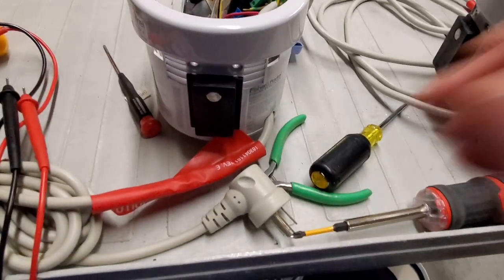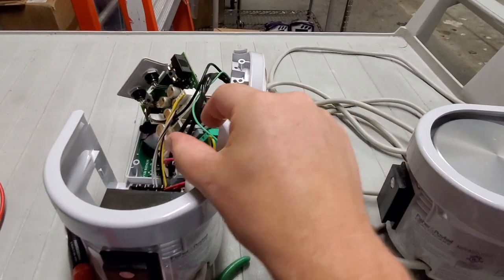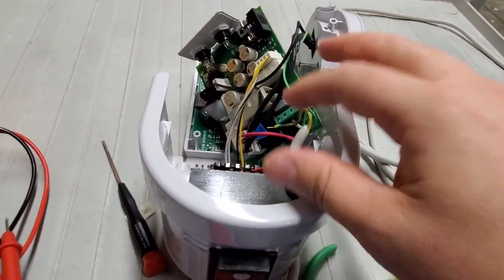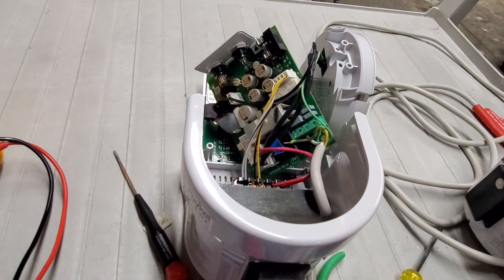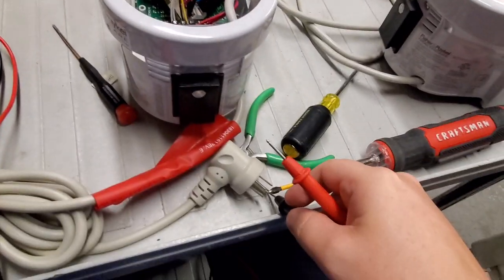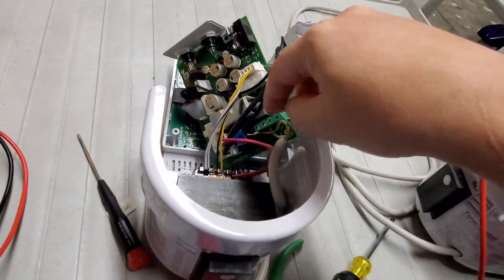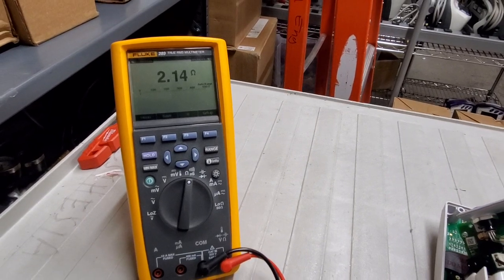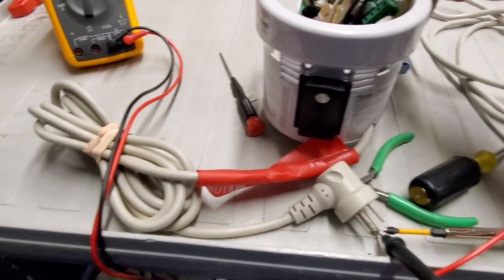So when you're doing electrical safety, what you're doing is you're going from the ground pin right here. Basically, that common bus should be close to 0 ohms to the platter. And we're currently getting multiple ohms worth of resistance. I'm just going to show you guys that if I put one lead down here and the other lead, I'm going to go and grab and stick directly on the other end of the power cord, I get 2 ohms.